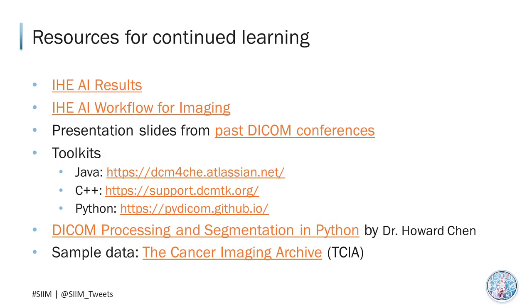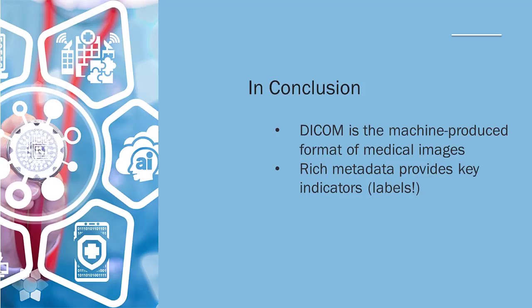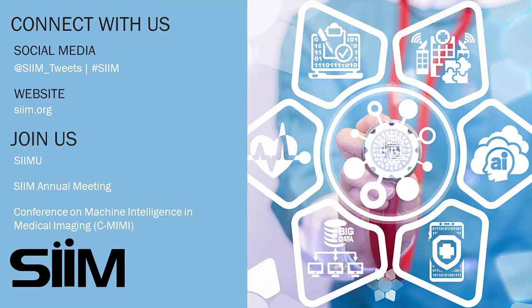Oh, that's wonderful. I can hardly wait to get to work. Cool. So tell me, what have you learned today? All right. So what I've learned is DICOM is a standard format for medical image storage and transmission. And in addition to the pixel data, it includes loads of metadata that can be useful for a plethora of analytics use cases. You've got it. So keep an eye on other resources and courses in the CDI series as well as on the SIIM resource website.